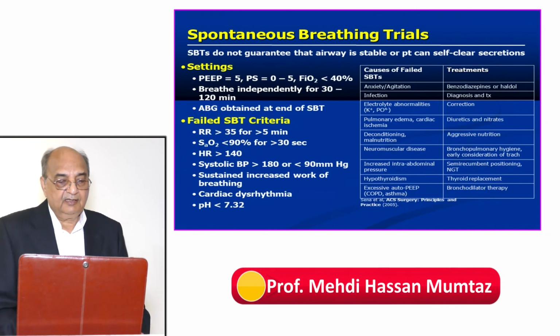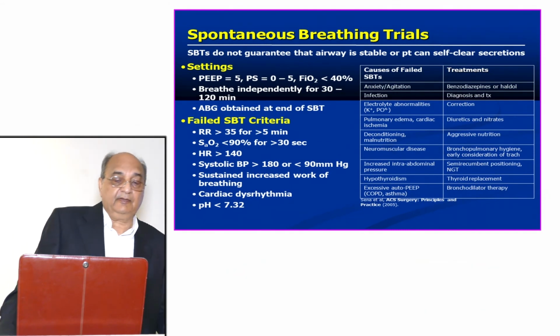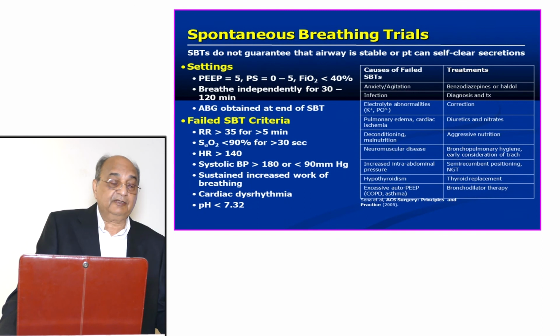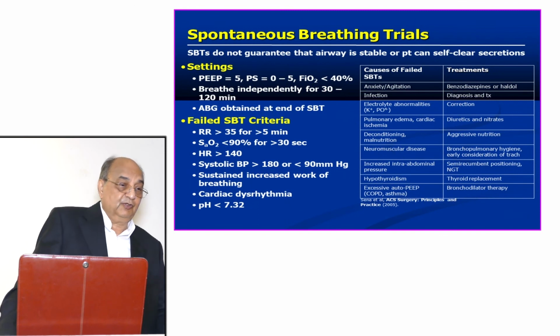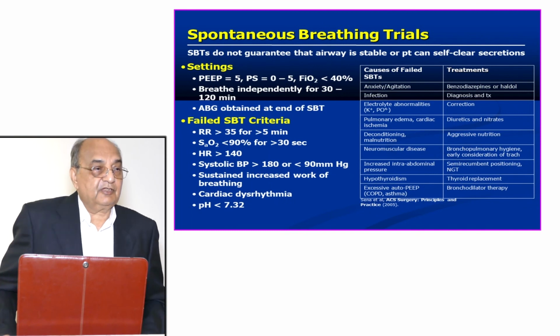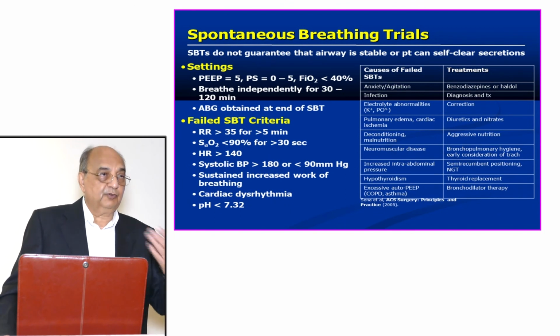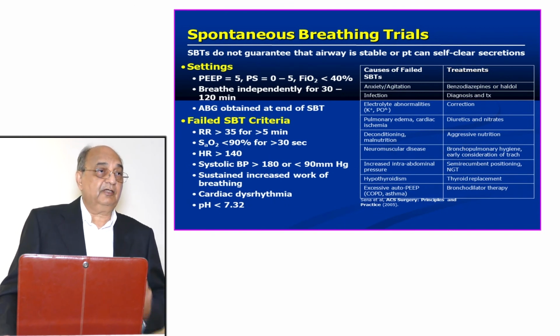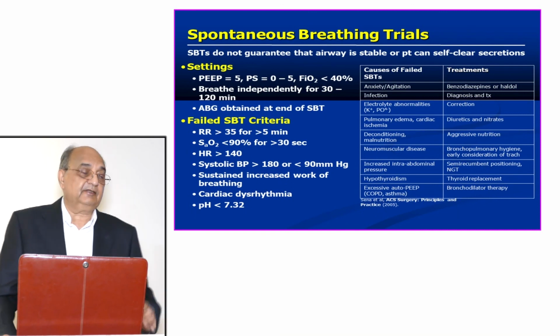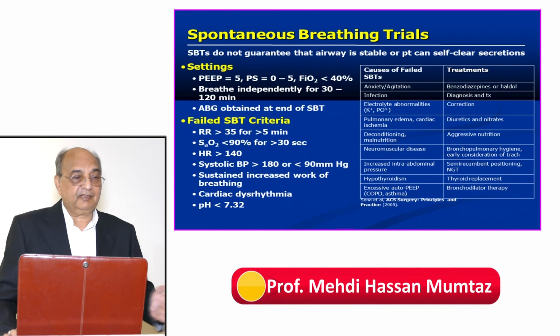Now in this, before you actually come to the extubation level, you will have to give the patient spontaneous breathing trials also. So there is a big list of criteria for successful spontaneous breathing trials. If it is unsuccessful, you give time again, then you do the extubation. It is individual for every patient, it is a practice like this. So I will not go into detail on this, I will go on to the next lecture.